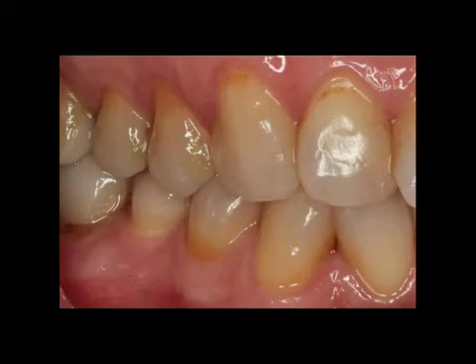You can see a little bit of the white on that crown. You can see a little bit of the implant, but the patient is just not going to say anything about that. We're never going to hear about, oh doc, you left a little bit of white in my mouth. The recession around the other teeth is yellow. And in fact, some of the patients come back and ask for the same whitening on the roots of the other teeth.